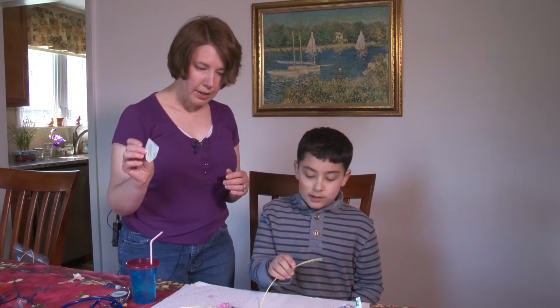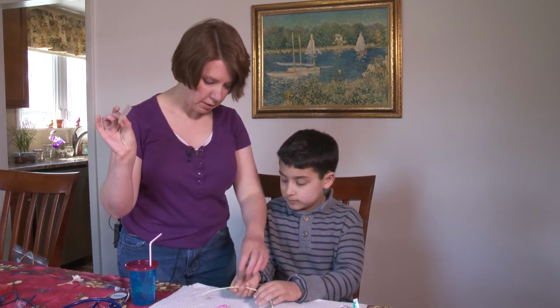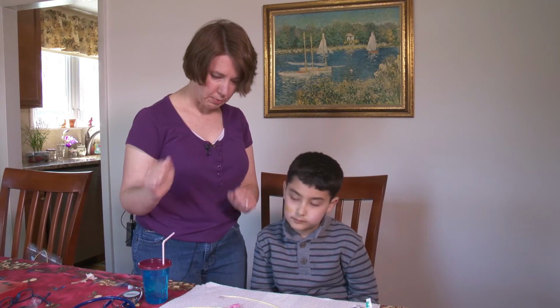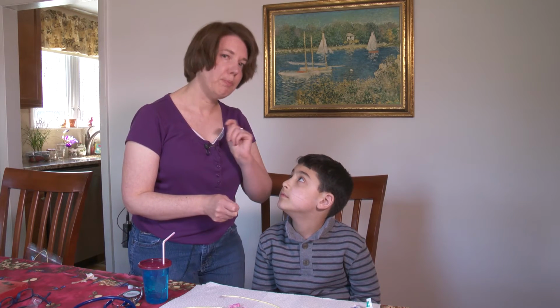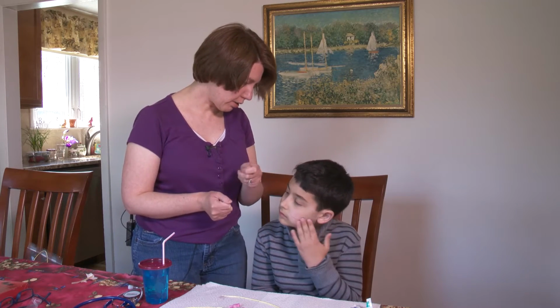So the things you want to have handy, you want to make sure that your stethoscope is right handy and that your piece of Tegaderm is right near, you know where those things are, because when you need them kind of quick, because once the tube is in, but before the guide wire is out, it's a little uncomfortable until you get that guide wire out, and then it's better, right?